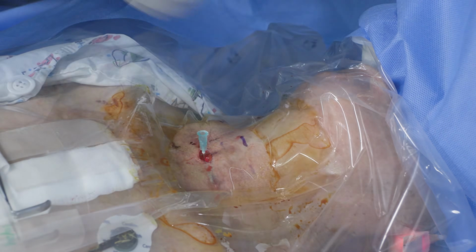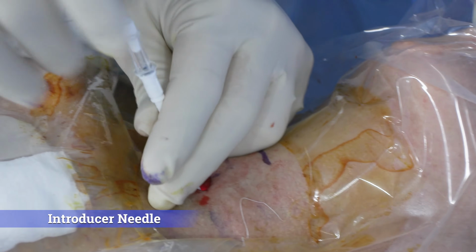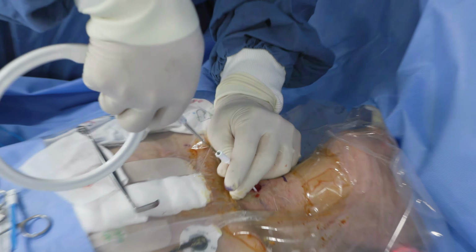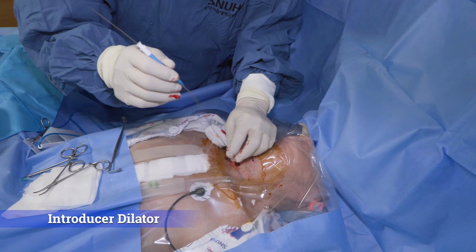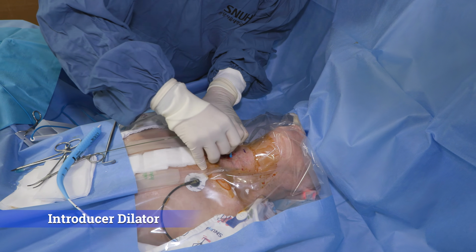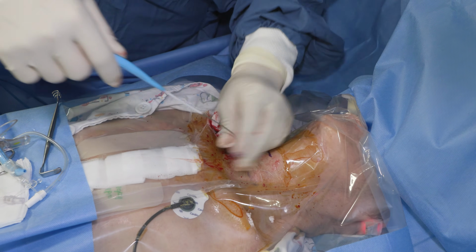A 15-gauge introducer needle with a sheath is then inserted. At this step, the bevel of the needle should face downward to facilitate the downward advancement of the guide wire. When inserting the guide wire, ensure that it advances toward the carina rather than upward, and confirm its direction under bronchoscopic guidance. After the guide wire is inserted, the first dilator, a 14 French introducer dilator, is used.